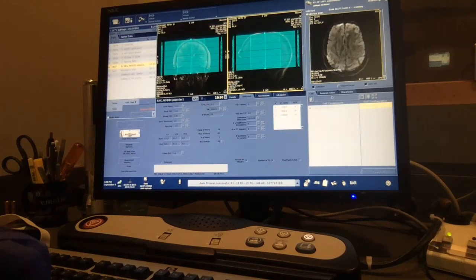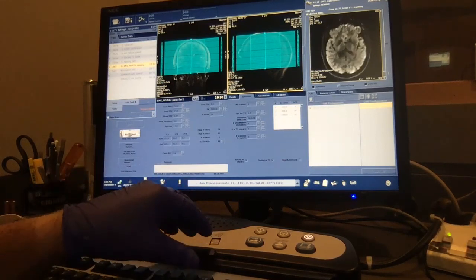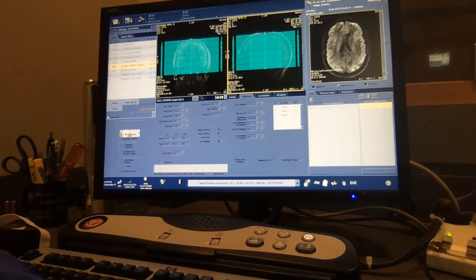It gets acquired in different directions, and it can be acquired at different strengths. And again, you can see these images are now even more different. We're actually encoding diffusion at a higher b-value here, so those images look a bit different with that diffusion weighting.